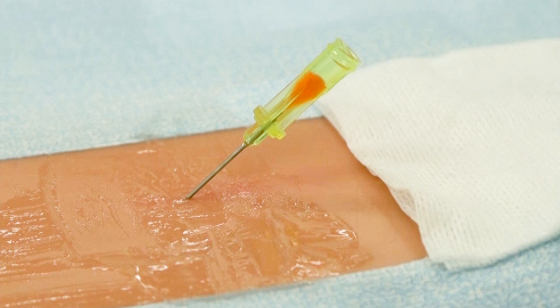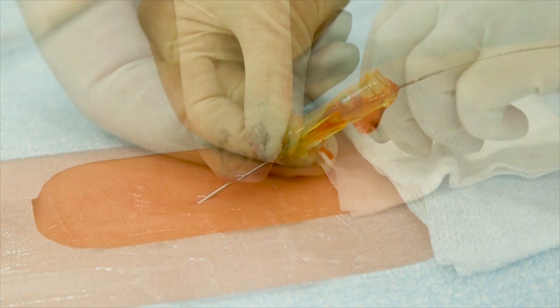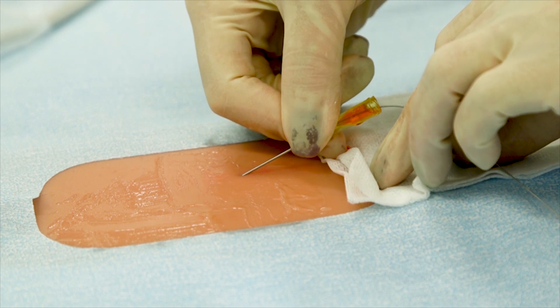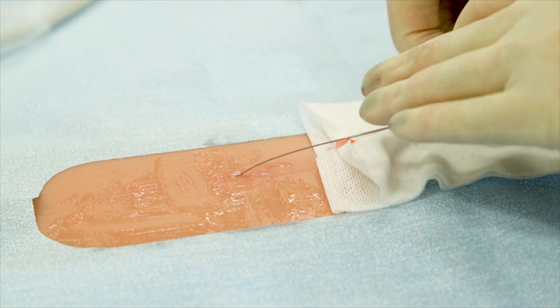Lower the placement device assembly slightly. Stabilize the position of the introducer needle and carefully advance the placement wire through the needle. The reference marks on the wire indicate that the wire has exited the distal needle tip. While holding the wire, remove the introducer needle. If resistance is encountered during wire advancement, withdraw the entire unit and attempt a new puncture.